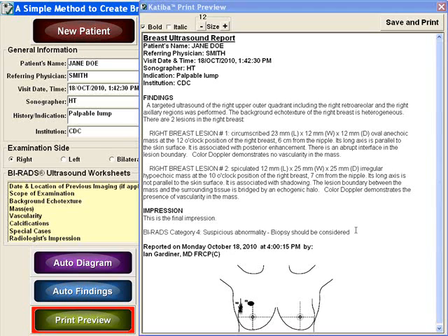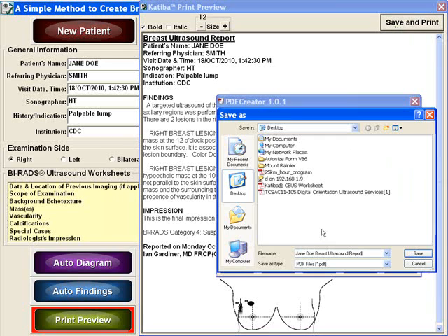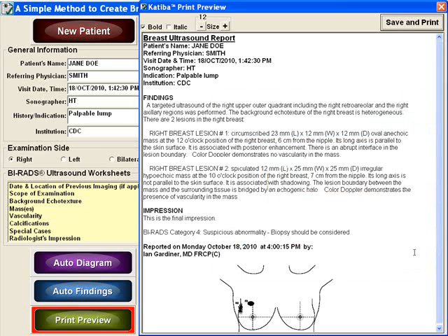Now that the report is completed, use the Print Preview button to save and print the report. The report can be saved as a PDF file to the RIS, distributed electronically to the referring physicians, faxed, or printed as a hard copy.